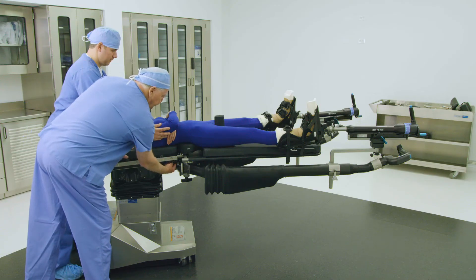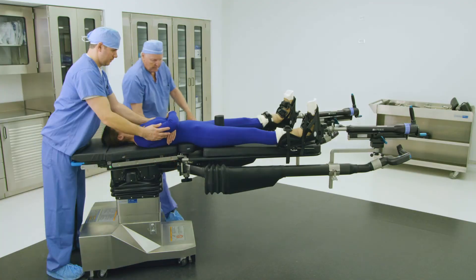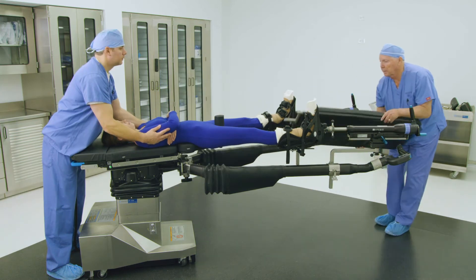Unlock the two knobs under the left and right side of the patient transfer board's prongs, found right above the abductor spar rosettes as shown. Remove the patient transfer board and return it to storage.